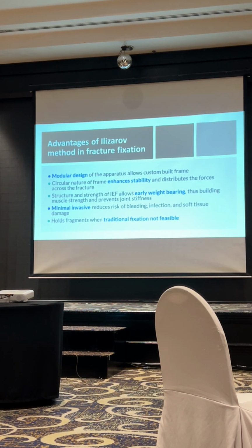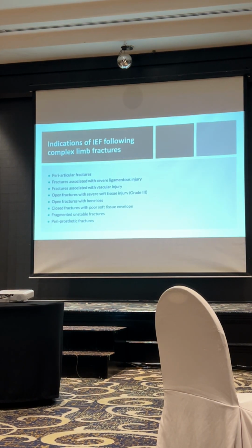It is most of the time minimally invasive unless you do larger bone resection. So of course you need to do some bone resection and wound debridement and so on, but most of the time it's minimally invasive. And then it holds fragments when traditional fixation is not feasible, meaning that if it's not plateable. Alright, next.